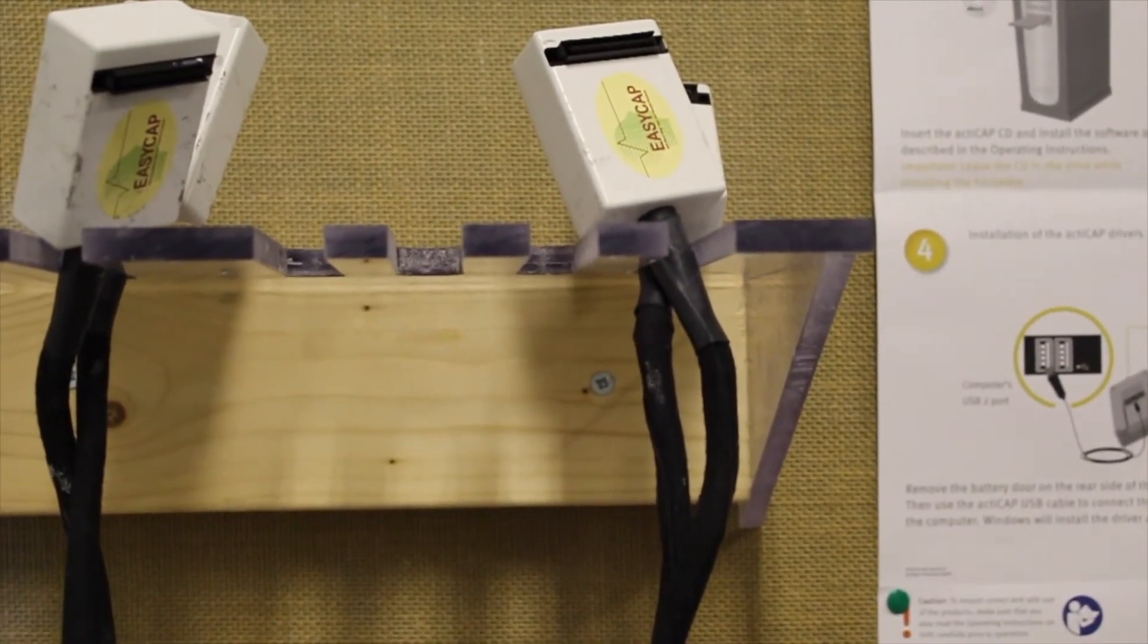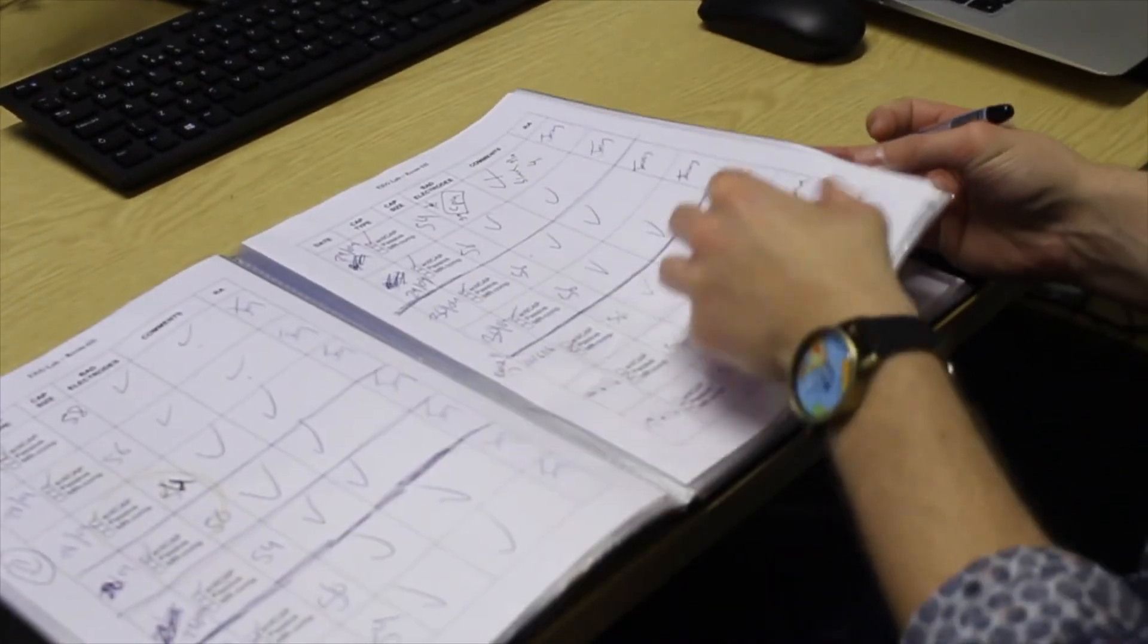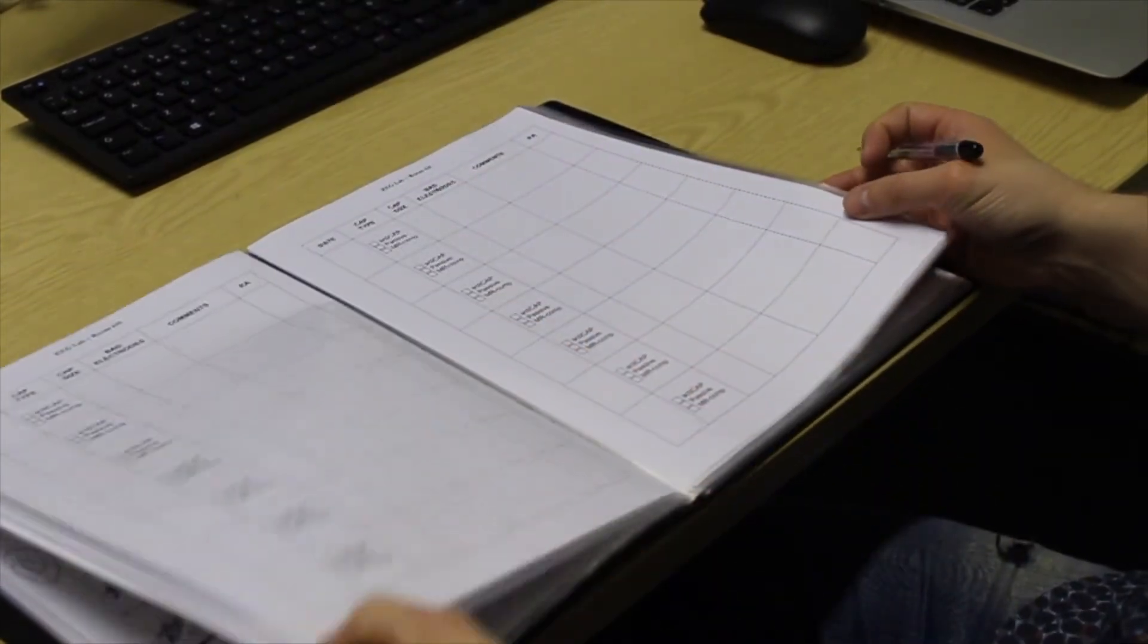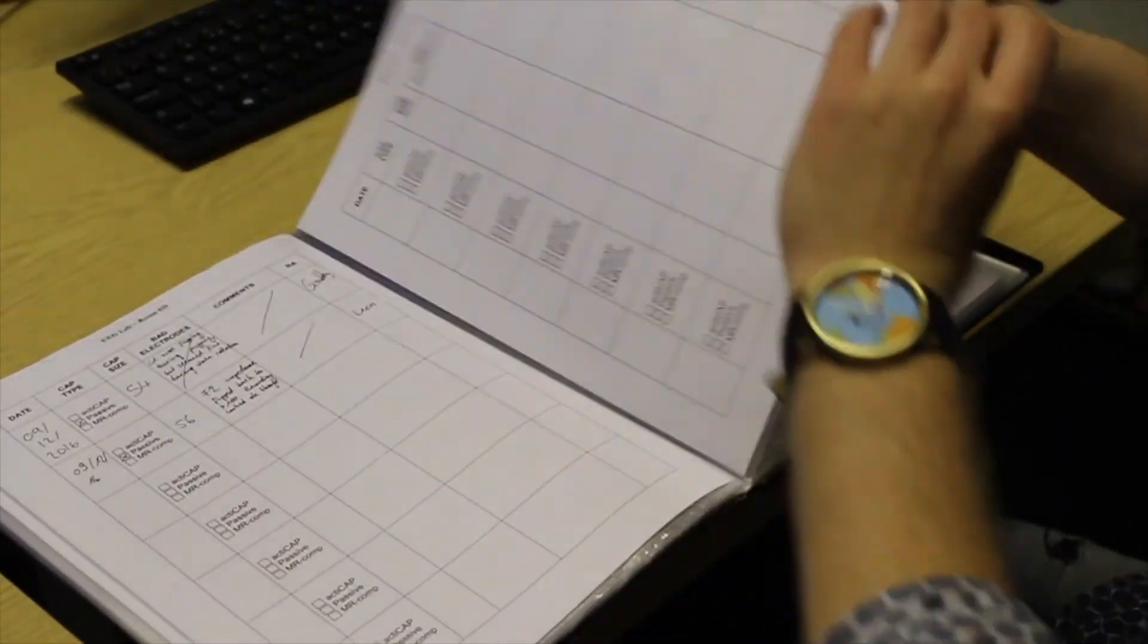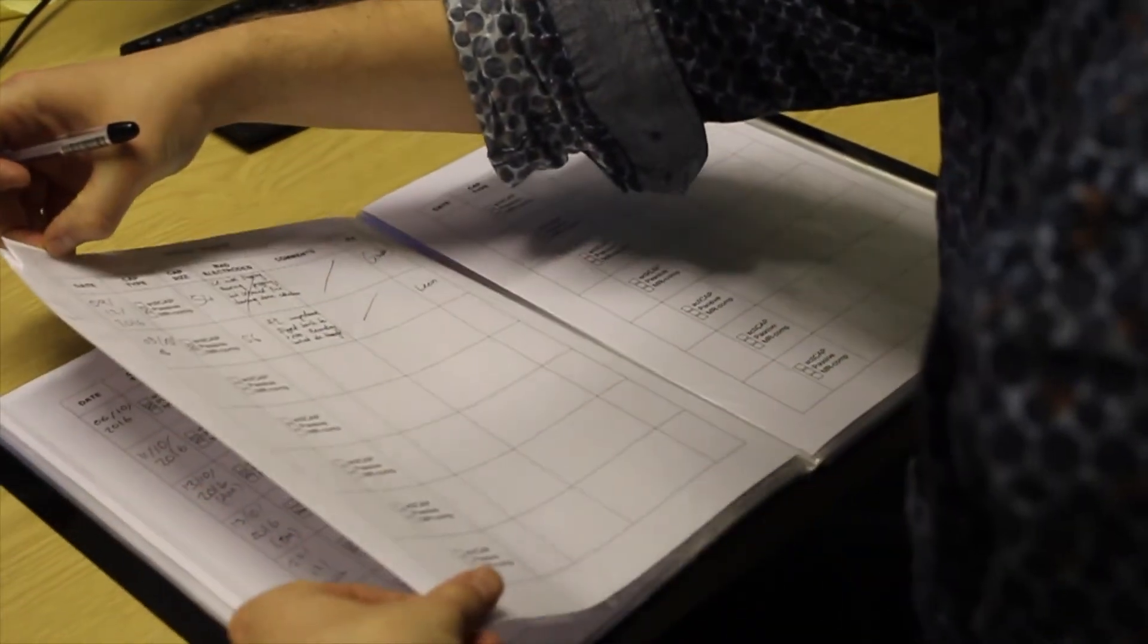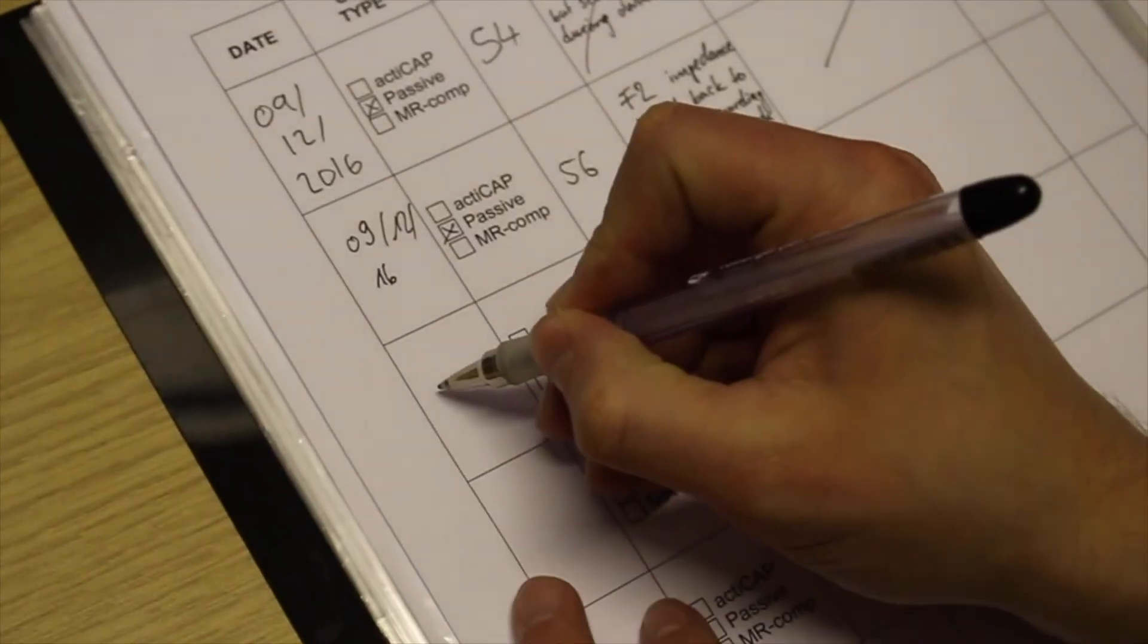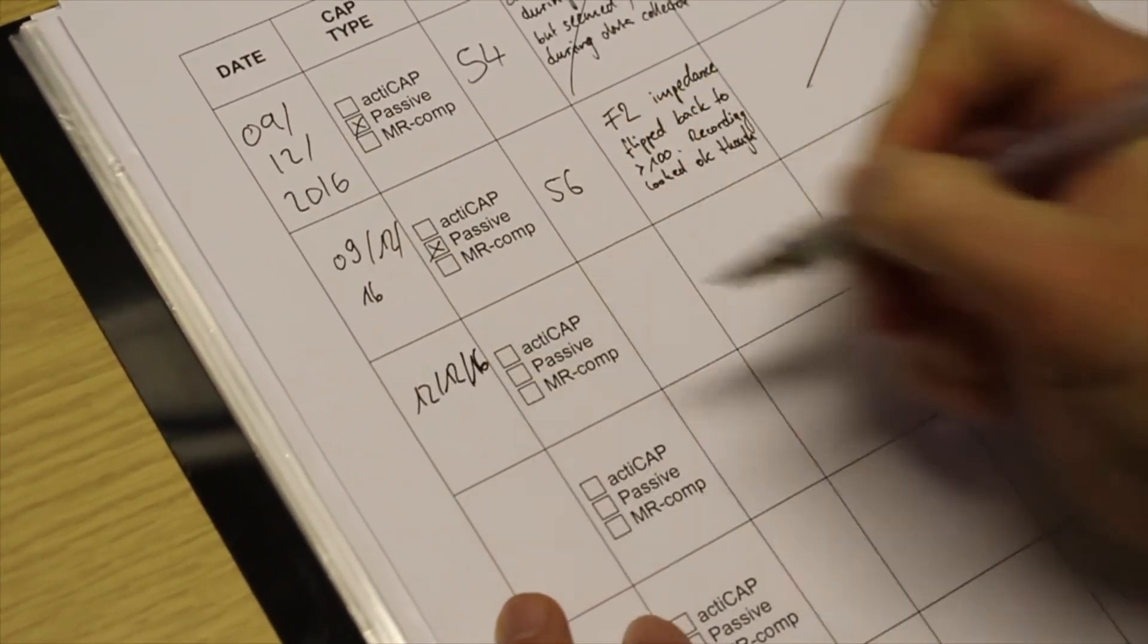You should log the details of every EEG session both for yourself and in the lab EEG log. This may be in the form of a physical book kept in the lab or it may be an online spreadsheet where you can add an entry each time you use the EEG room. This should include details of the size of the cap, who was running the experiment, and if you had any problems such as an electrode looking faulty.